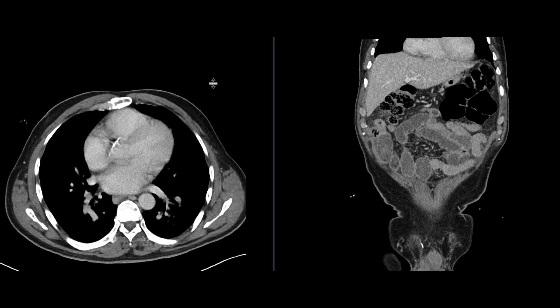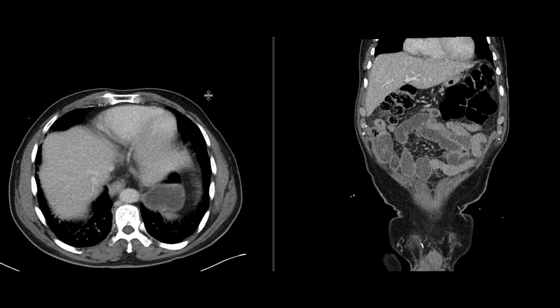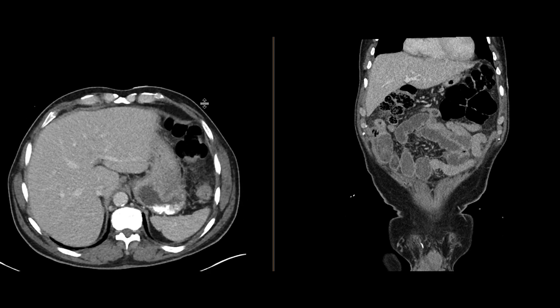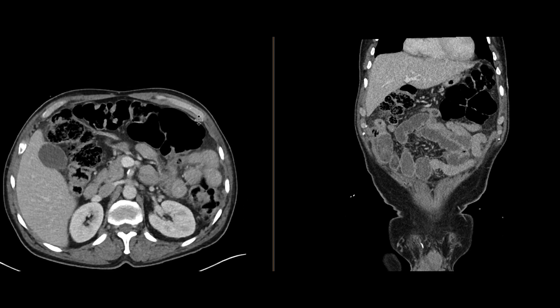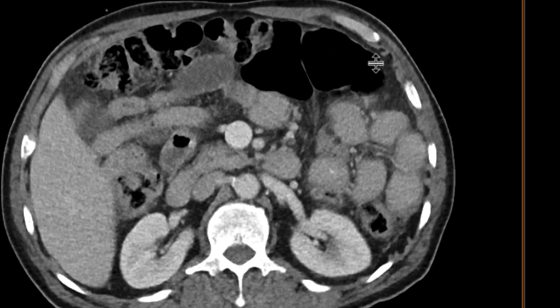This is a patient who comes in with abdominal pain, and we got a CT scan with intravenous contrast. We didn't give any oral contrast for this patient.